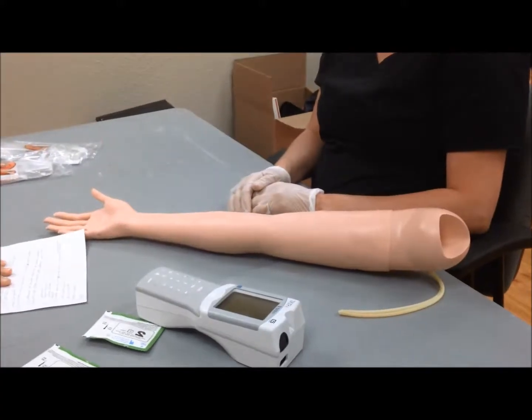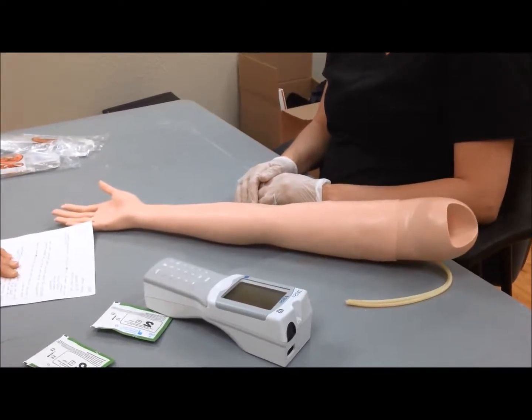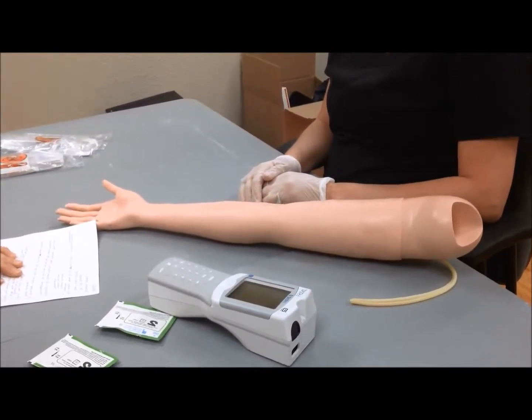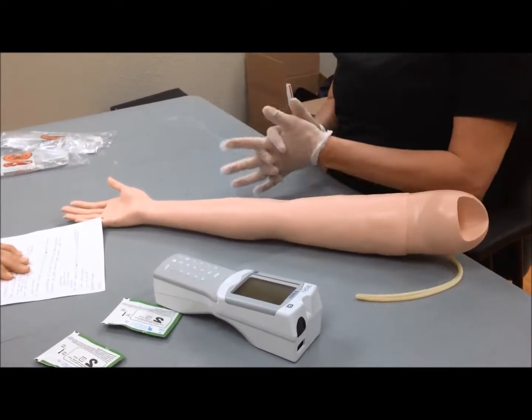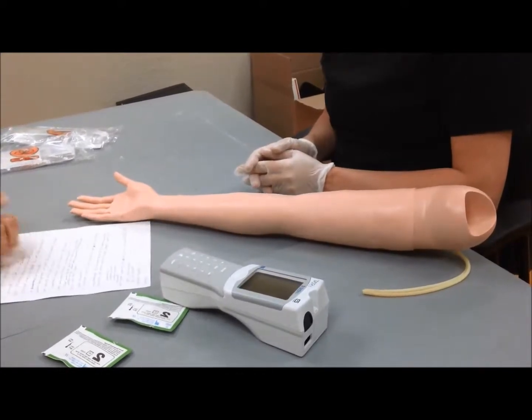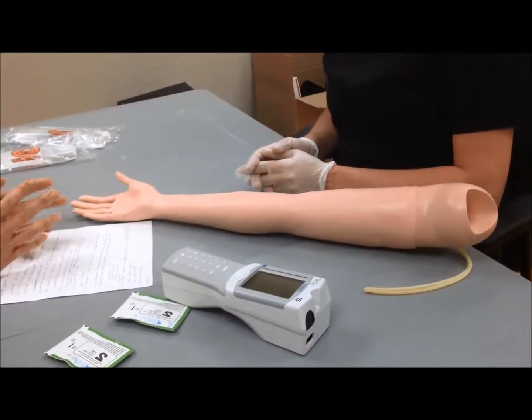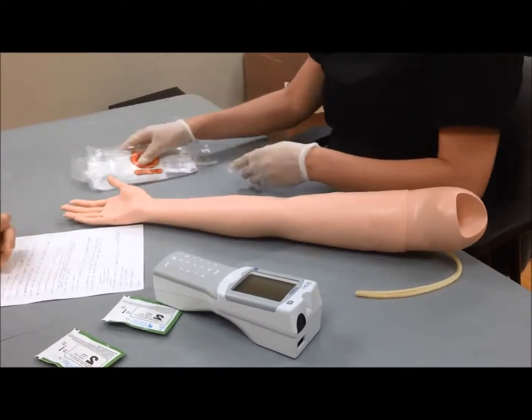We are going to demonstrate the procedure for an ABG draw. First of all, you need the doctor's orders, the patient ID number, which is found in the patient's chart, your code number, which is located on the cupboard door in the iStat room. You need several ABG kits. I would suggest taking 3, as 3 tries is the most you can do at one time.